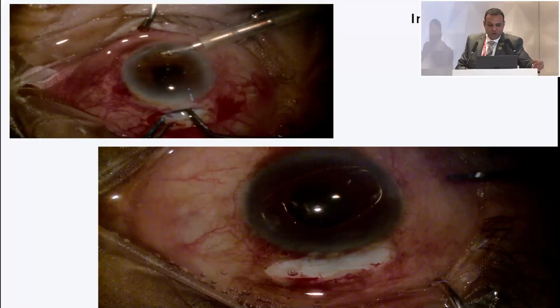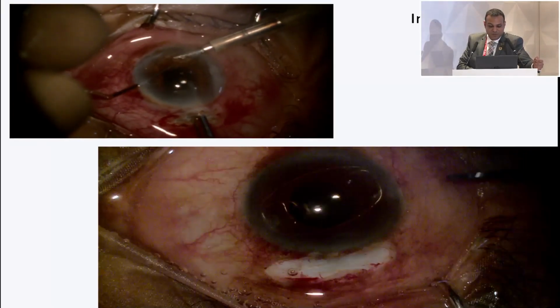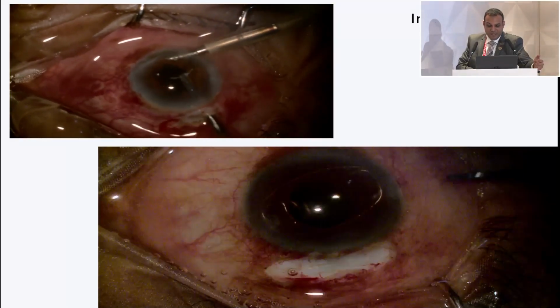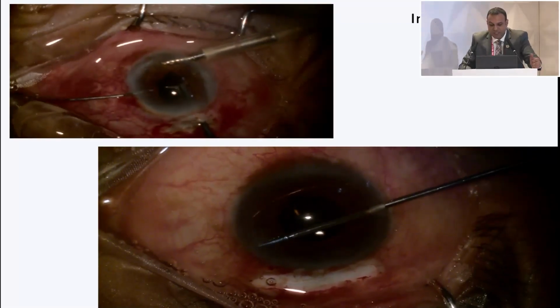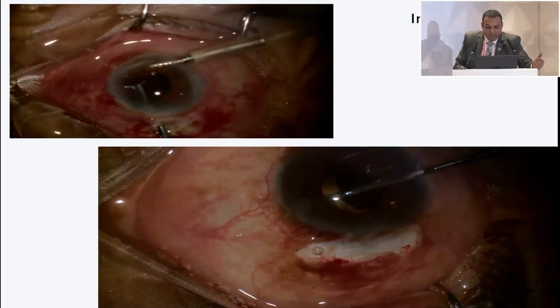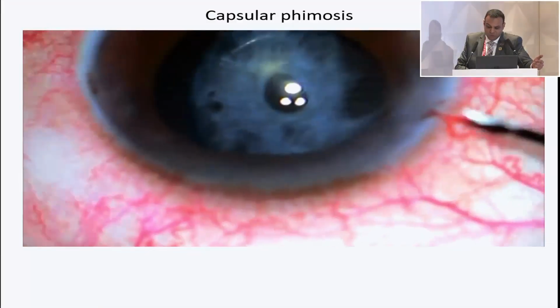So there was a lot of discussion on iris claws. So this is another technique I learned. I've not done too many of these, but instead of holding the iris claw with the iris claw forceps and enclavating it on either side, another technique that Saumil came up with was pushing it in and then moving the lens to the position where it has to be fixated, and then going in from the side port, holding the haptic, using your second instrument to enclavate it, and then repeating the same procedure on the other side. That kind of reduces the pressure that you put on the globe.